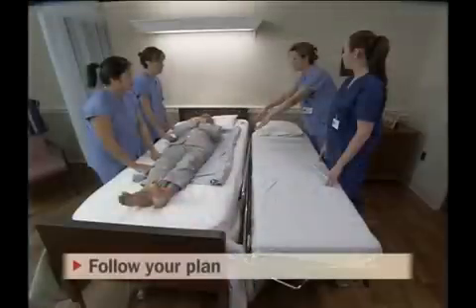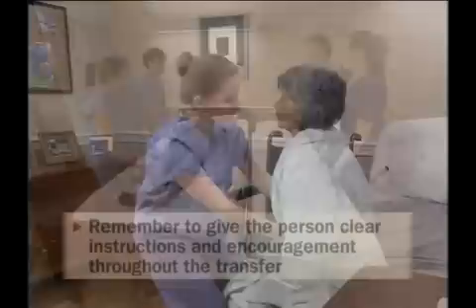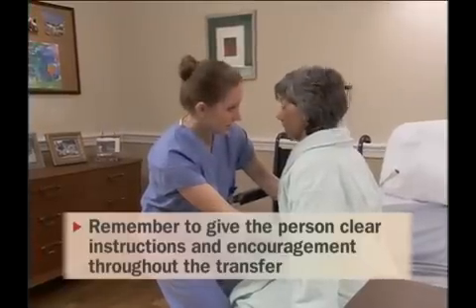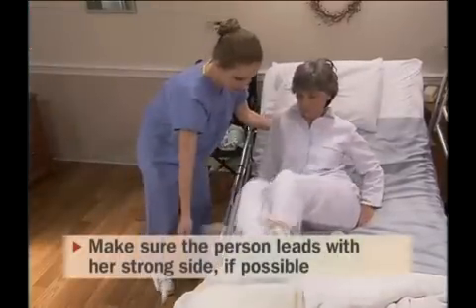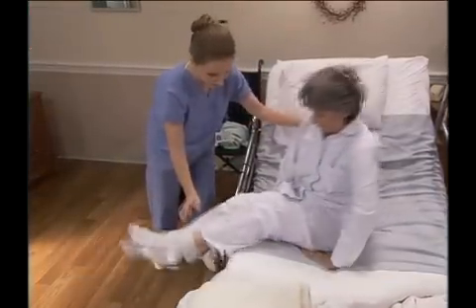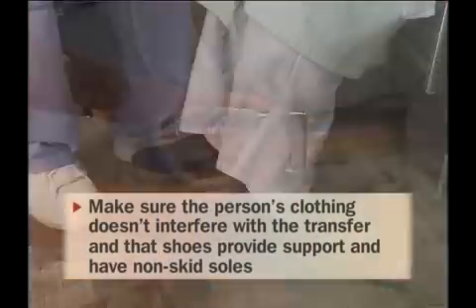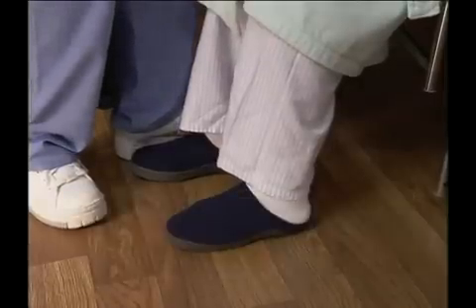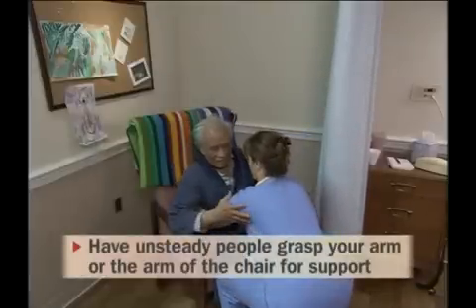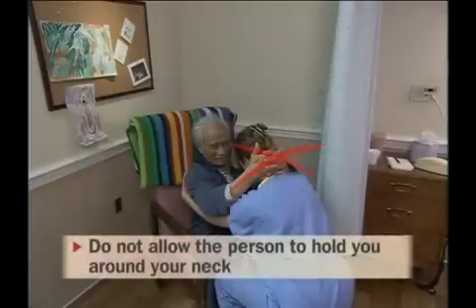To keep patients and residents safe during transferring procedures, follow your plan, whether you're working alone or with assistance. Remember to give the person clear instructions and encouragement throughout the transfer. Make sure the person leads with her strong side if possible. Make sure the person's clothing doesn't interfere with the transfer, and that shoes provide support and have non-skid soles. Have unsteady people grasp your arm or the arm of the chair for support. Do not allow the person to hold you around your neck.